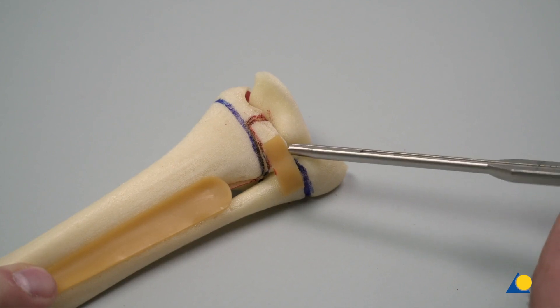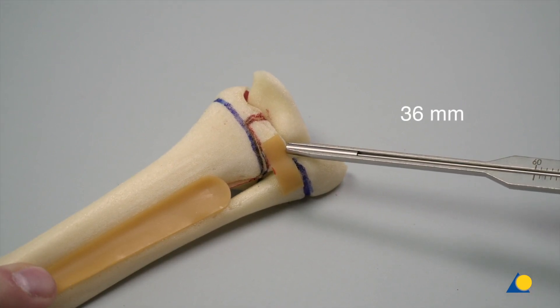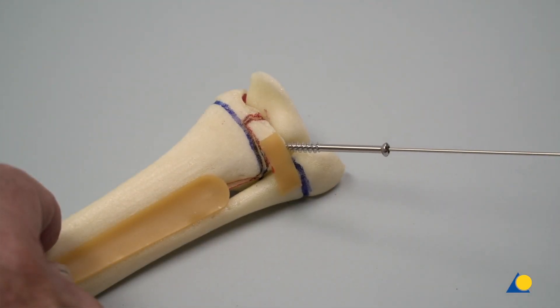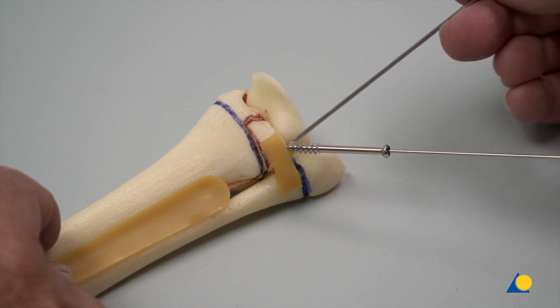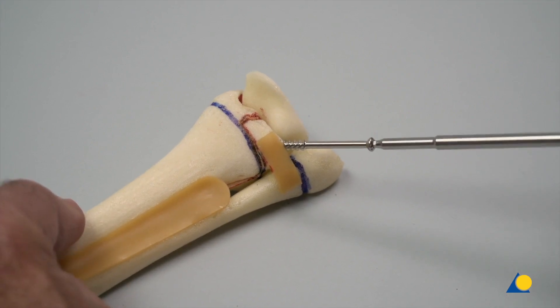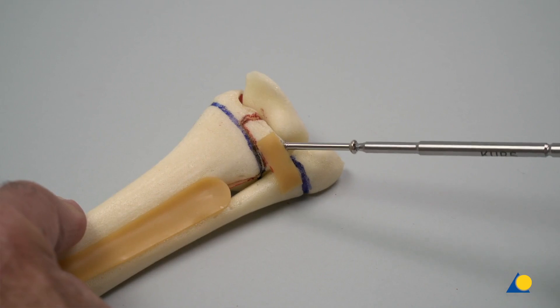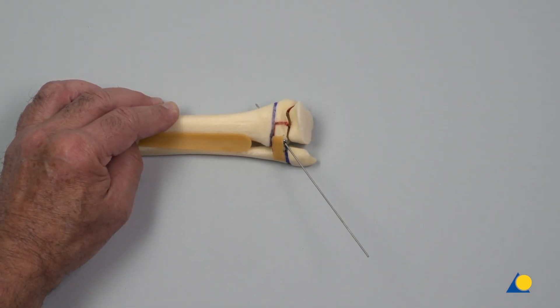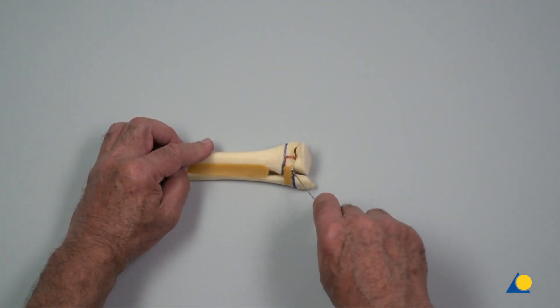The screw length is measured with the depth gauge. A 4.0 mm self-drilling, self-tapping cannulated screw is slid over the guide wire. In a clinical situation, an incision for the screw would be necessary. The screw is inserted using the cannulated hexagonal screwdriver. The joint surface is reduced and compressed. The guide wire is removed.